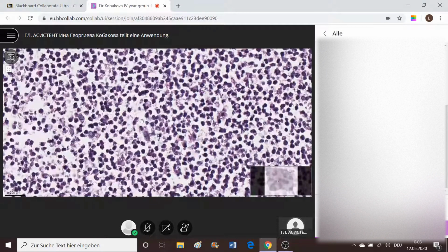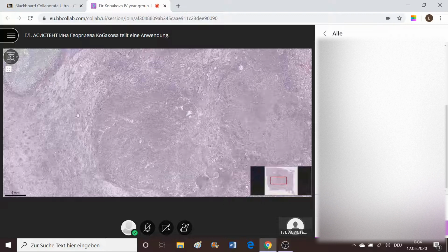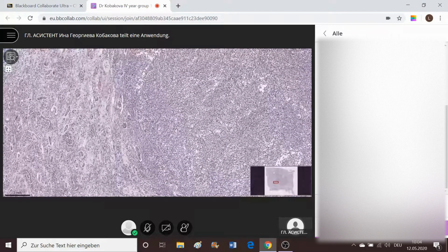So this is acute pyelonephritis. With what? Abscess formation. They are forming abscesses inside. Those are cavities which are filled with inflammatory cells, leukocytes, and they are having borders which are marked as pyogenic membranes. The pyogenic membrane must be having a couple of layers depending on how long the abscess cavity has been inside in the organ. And these layers are majorly marked by granulation tissue.